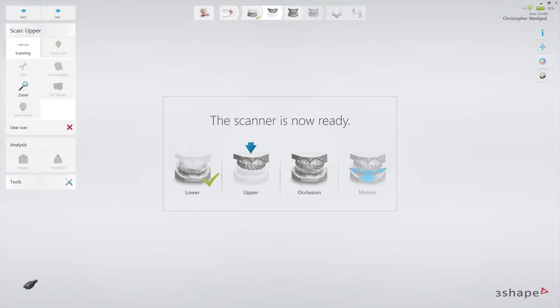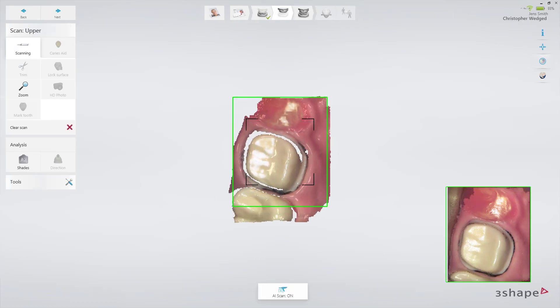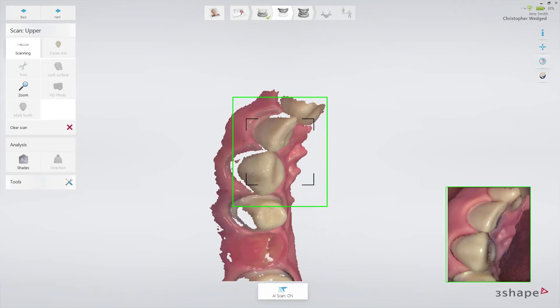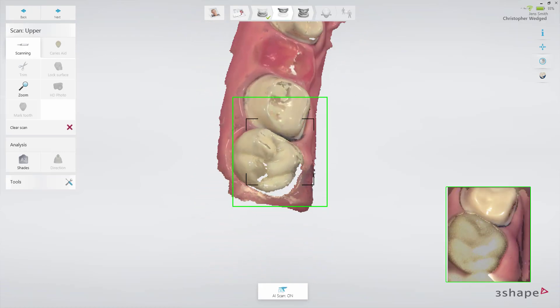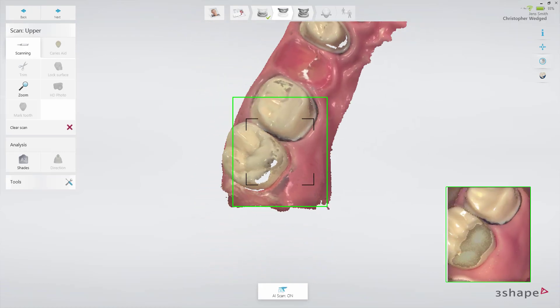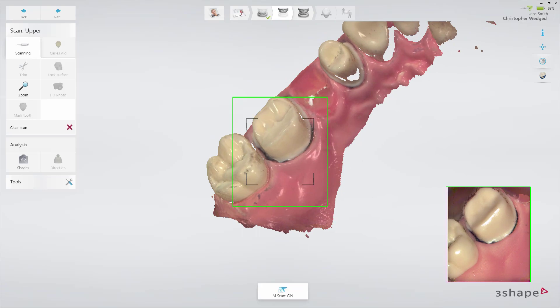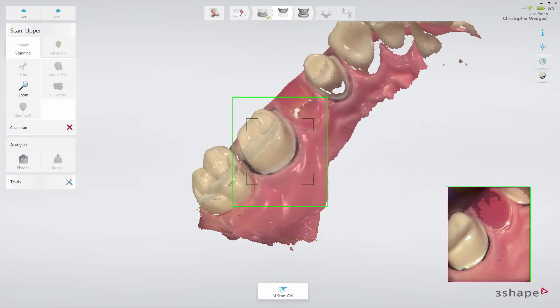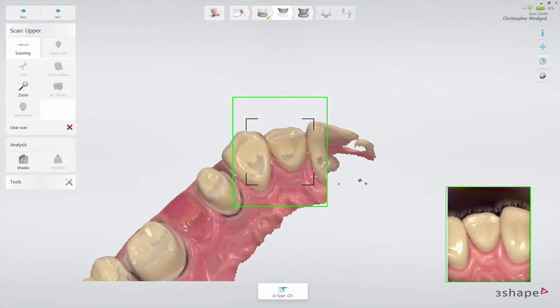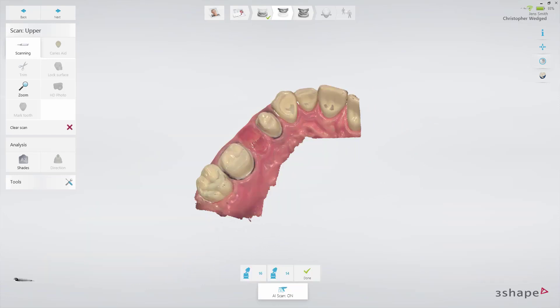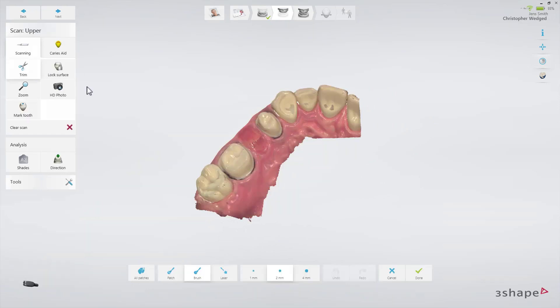The second option is to leave the retracted cord in place and scan the arch following the scan strategy. Then, trim away the margin in the scan with the trim tool.